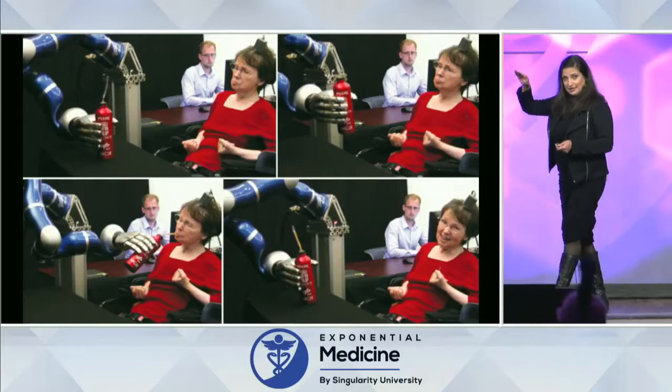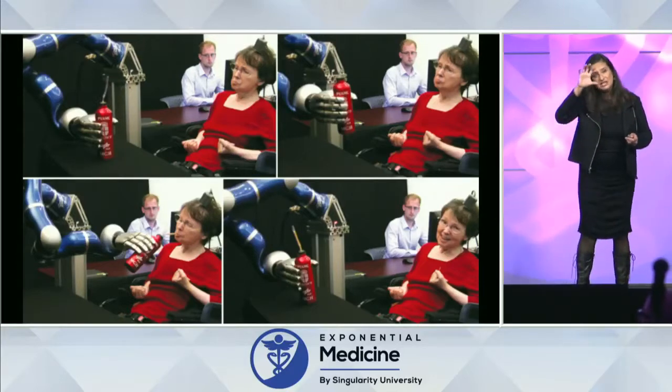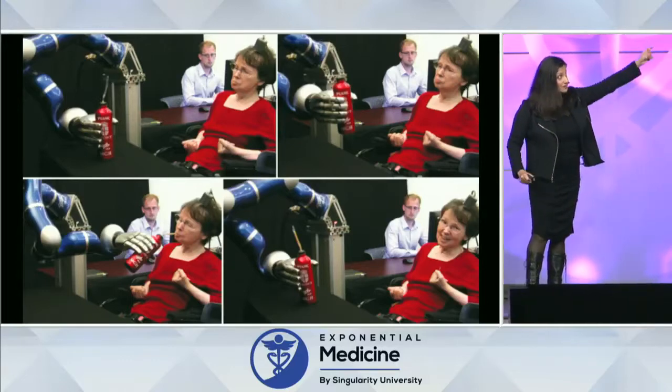And what they've done is to implant these electrode arrays within the brain, and these intercept the thoughts of the patient, and you see in this particular set of photographs, this particular patient, who is a quadriplegic, is using her mind to control a robotic arm outside herself to bring a carafe of coffee to her mouth, okay? So this is kind of an amazing thing, people using their thoughts to control actuators in the real world.